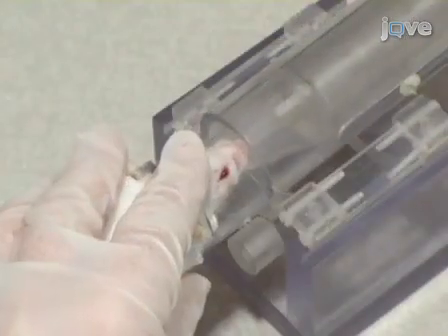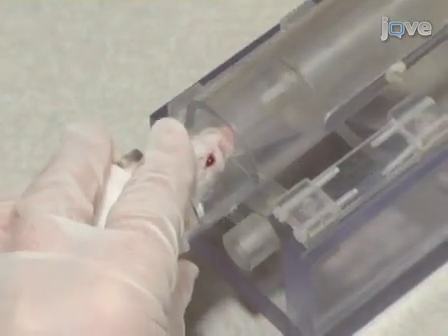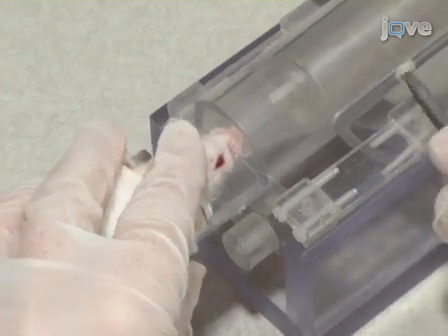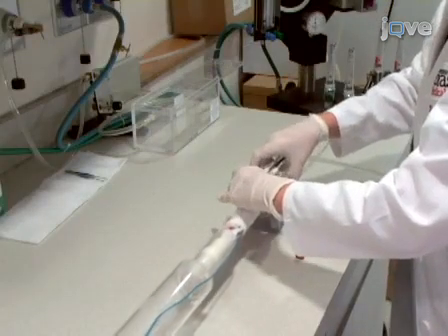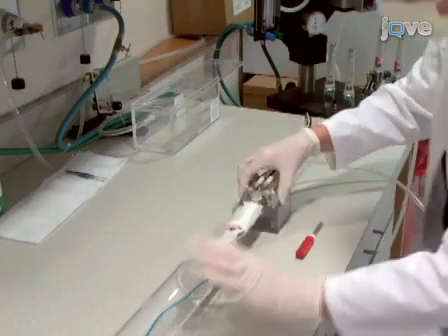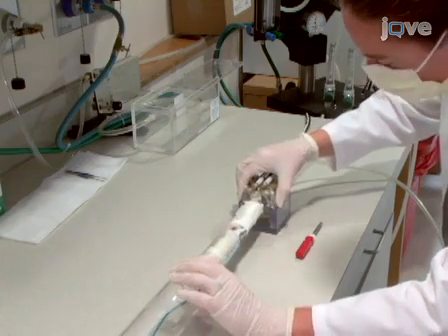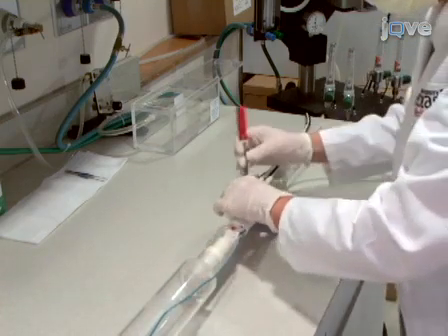The animal holder should be equipped with an adjustable tooth bar, allowing for vertical and horizontal alignment of the head. Ensure that the head is properly positioned in the caudal rostral direction and that the head is not rotated. Check that the surface coil is properly placed on the head.